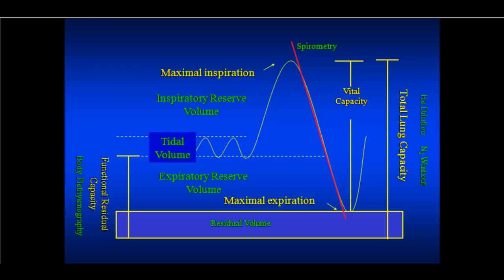All right. There's the expiratory reserve volume. So if we can calculate the FRC, we can measure this by the spirometry portion of the lung volume measurements. We always do a spirogram when we do the lung volumes, and that's what gives us our other volumes here, inspiratory capacity and so on.